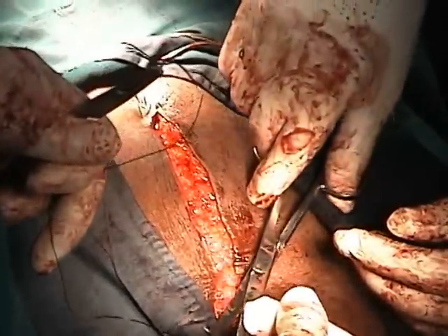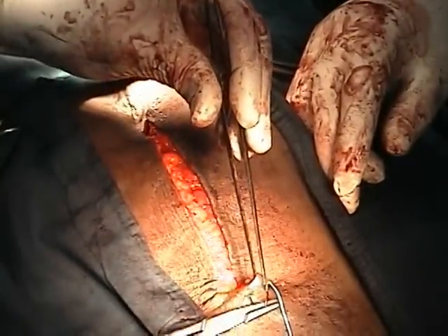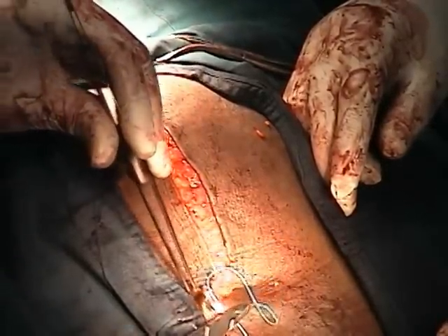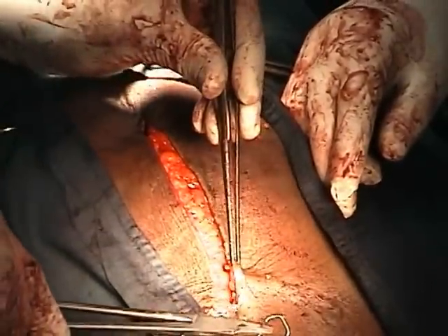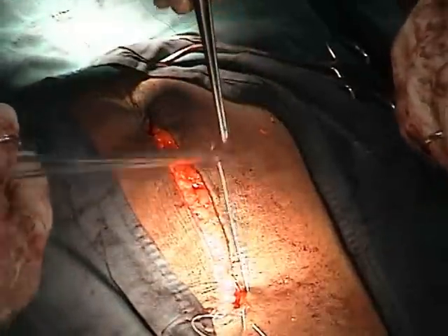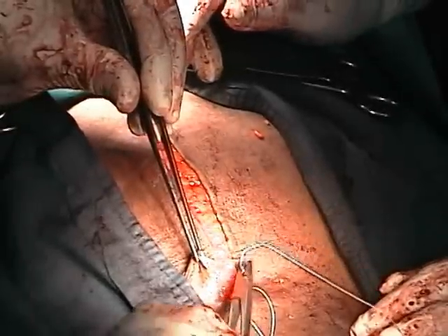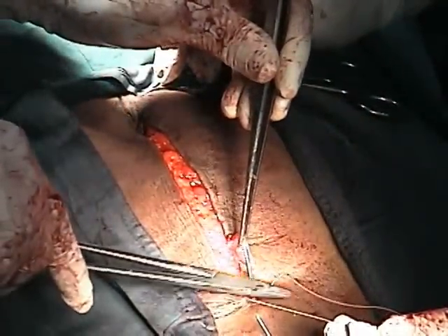So now the rectus sheath has been closed completely, and the final stage of the surgery would be to close the skin incision. And for this skin closure, we are using rapidly absorbed Vicryl. This is Vicryl 0, but this dissolves faster than the Vicryl that has been used. This is called Vicryl Rapid. And the skin here is closed with a subcuticular stitch. And once the skin closure is done, the surgery is over.